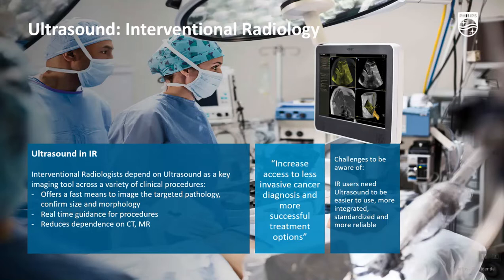Many times, CT is not always available for guidance of liver ablation. Some liver lesions can be difficult to see with ultrasound and CT. Also, CT can limit the operator's angle or approach during the interventional procedure. In these scenarios, multimodality image fusion with ultrasound for percutaneous liver tumor therapy can expand the number of cases that can be treated with ultrasound.